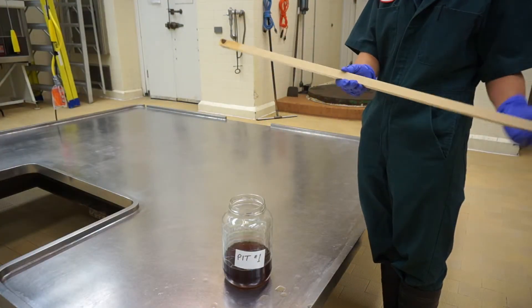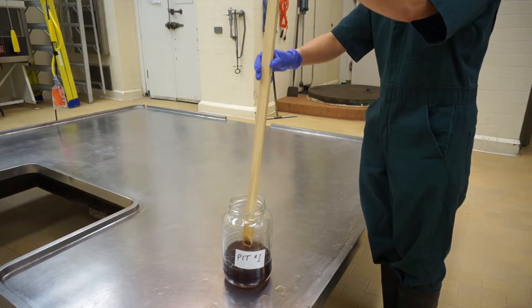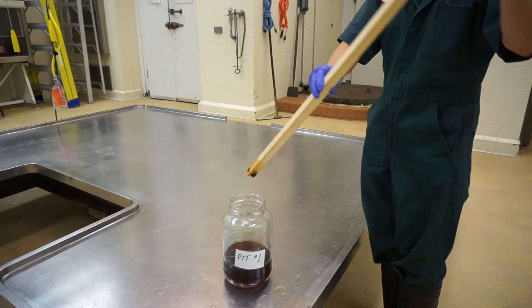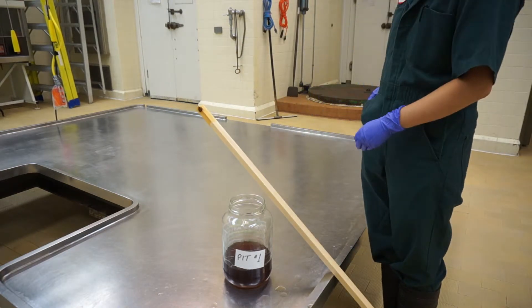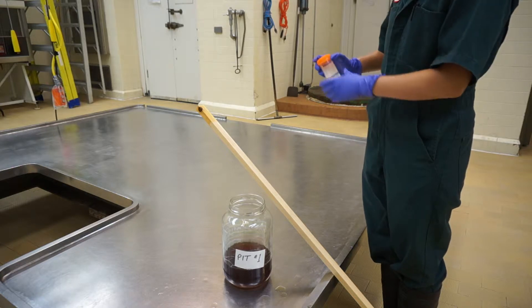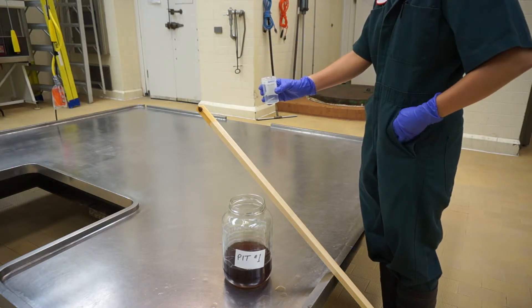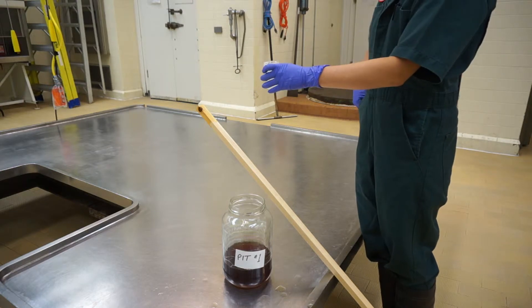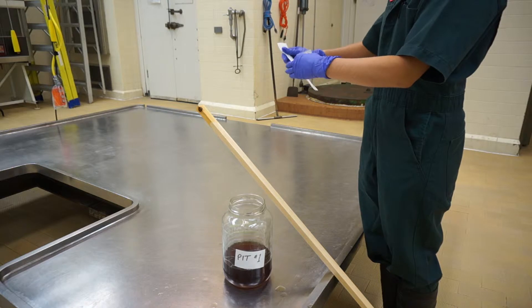Use a stick or gate rod to dip into the manure of the first pit and then place the rod on the ground. Twist open the orange top container and put its lid in your pocket. Holding onto the container, take a swab out of its packaging. Try not to place the container on the ground where it can get contaminated.